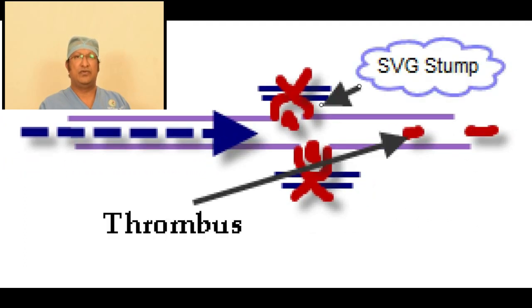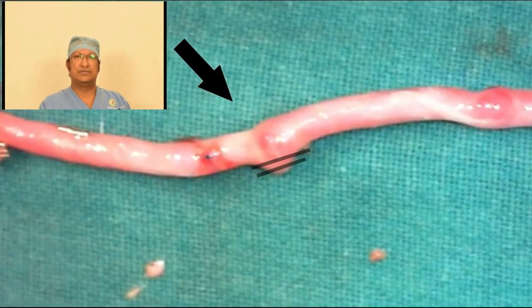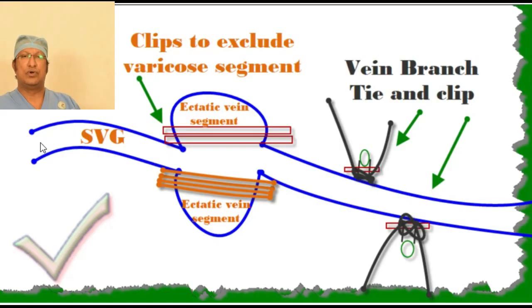Always ligate the branch flush with the vein wall, taking care not to constrict the lumen of the vein. The fourth thing one has to look for is weaknesses in the wall of the vein — the so-called local ectasias. Local ectasias are not good because they cause eddy current flow circulation within those weak areas.